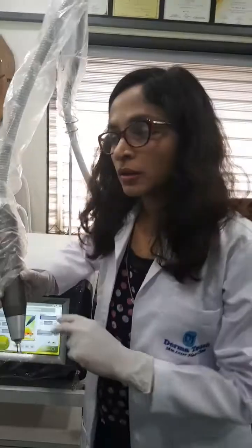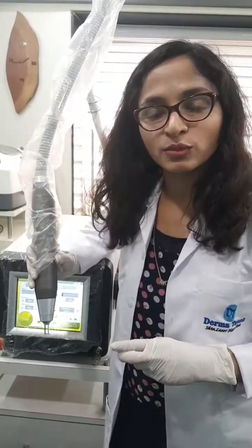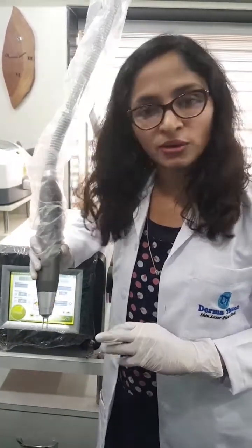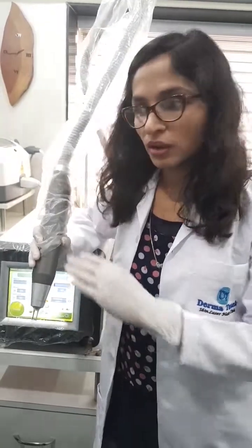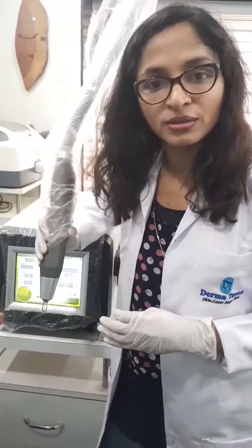This was her first session. Today we have done like this. We have to repeat monthly sessions — once a month like that. We say maybe minimum six to eight sessions are required for complete removal of the tattoo. We can treat it on any body part. Only thing is if the colors are like blue or yellow then it becomes a little difficult to treat.